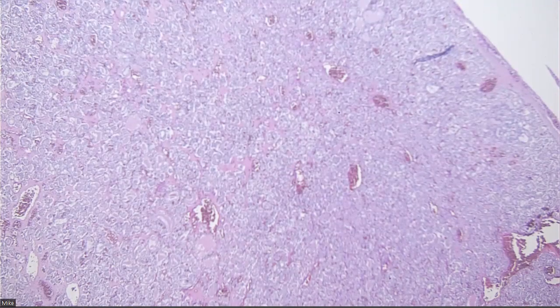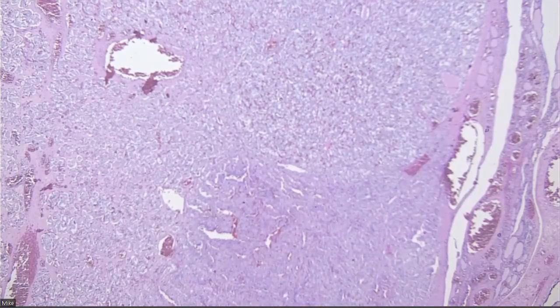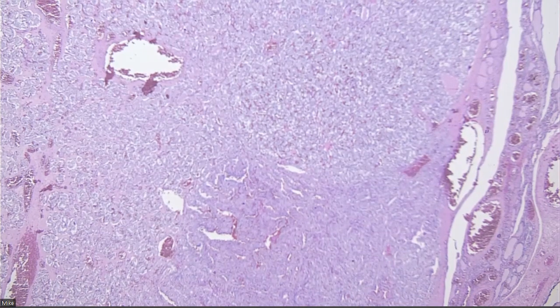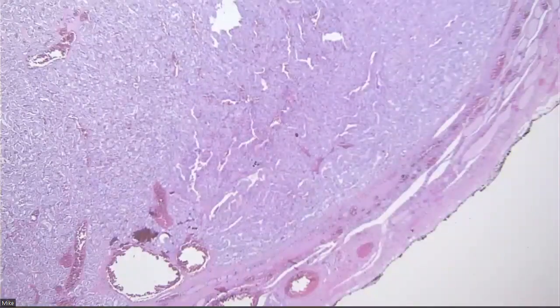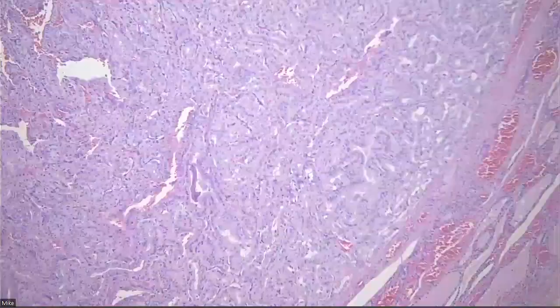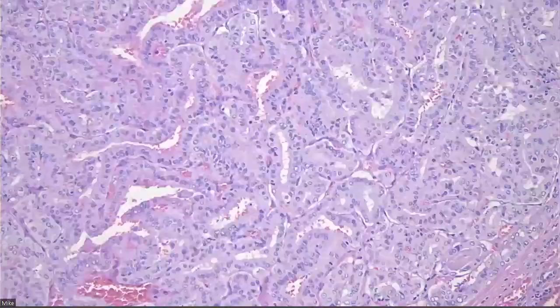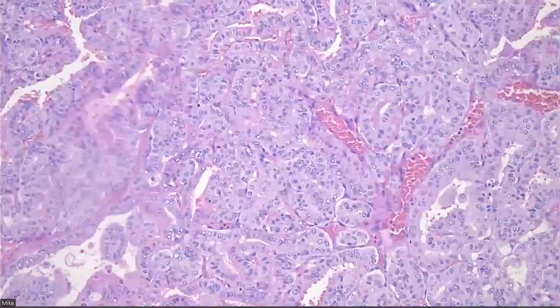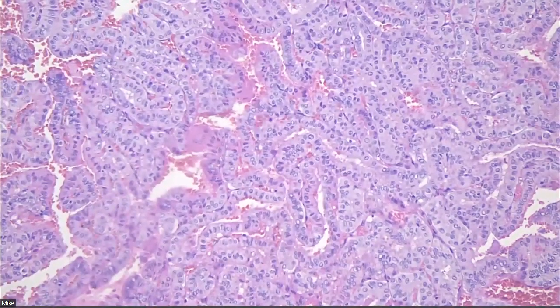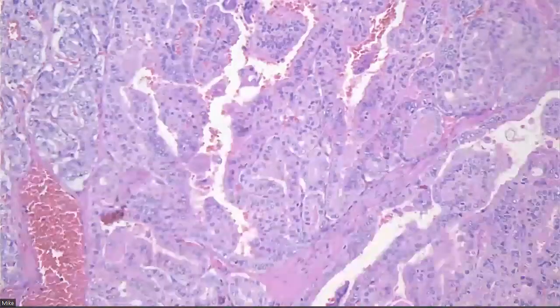The other thing that one can do is try and look at more of the tumor. So in a tumor that's small-ish, 2, maybe 3 centimeters, you can submit the whole thing. So this whole thing was submitted. And in one corner here, we have this area with much more robust branching papillary architecture that is a little bit more classic, right, for what we normally see in PTC, with this dense squamoid cytoplasm, with these taller cells, with these papillae that are nice and branching. But this area was really only focal. Oh, there's a nice inclusion, right?